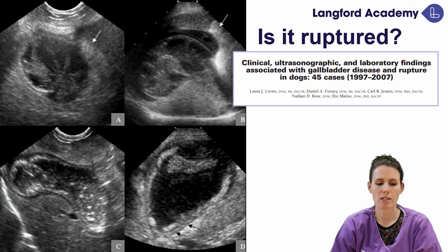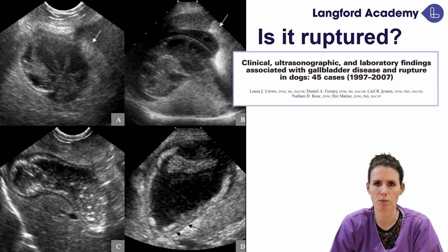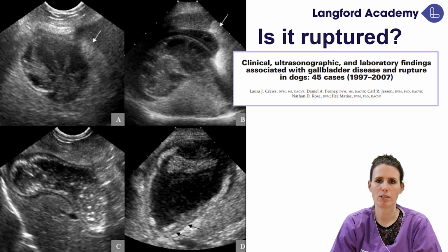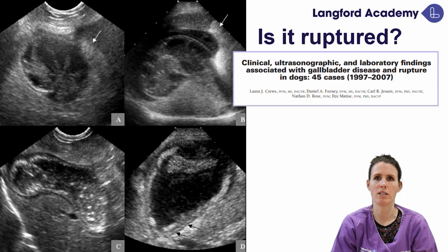And in addition to identifying the gallbladder mucocele itself, we often try and characterise other features. So for example, do we have any concern or suspicion for rupture? Sometimes this can be surprisingly difficult to identify, and ultrasound is recognised to be poorly sensitive for the detection of gallbladder rupture, as low as identifying 50% of cases of biliary rupture in some case series.